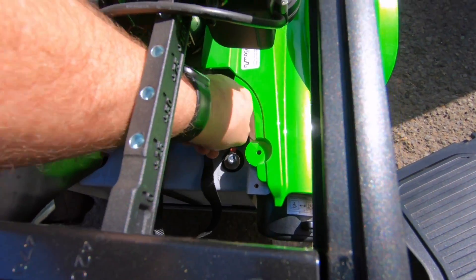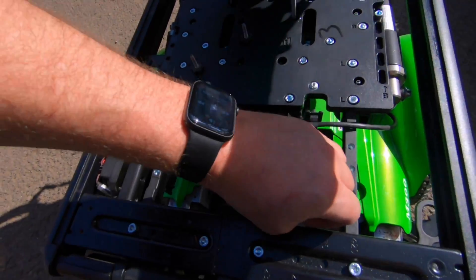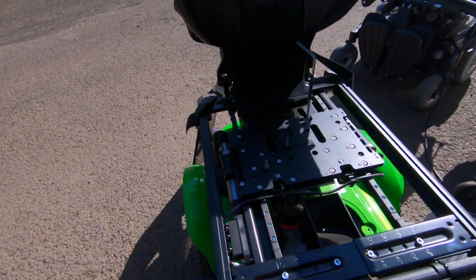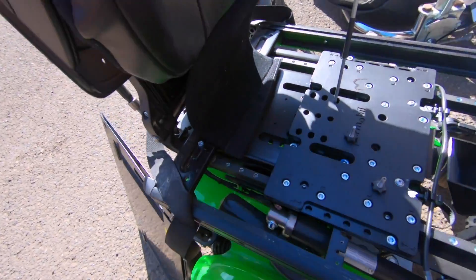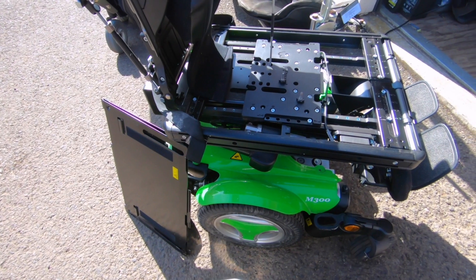And now I can work on getting this thing revived, or at least powered up. That's a real quick little thing on how to use this crazy long Allen wrench to adjust the height on a chair that's dead. We'll be right back.